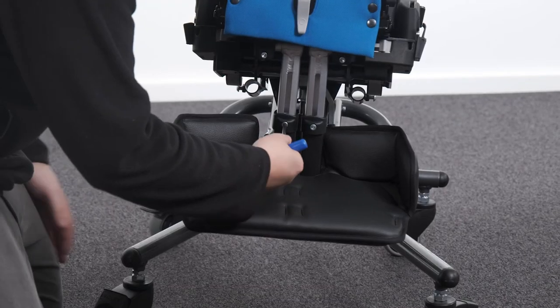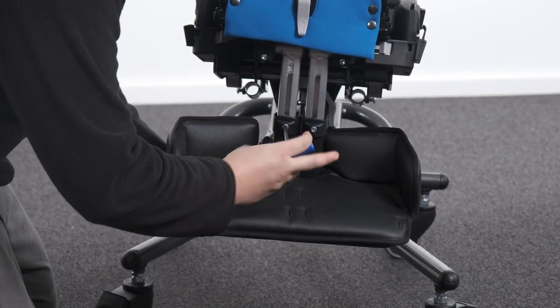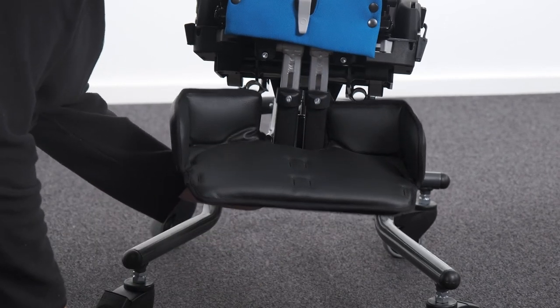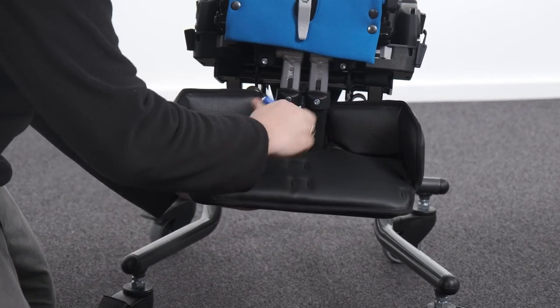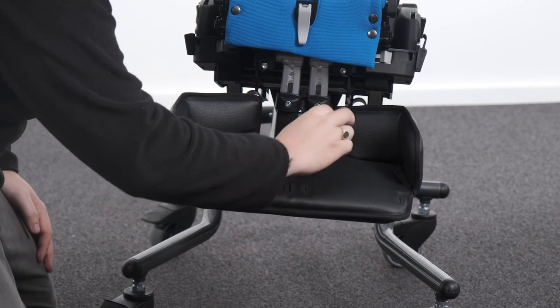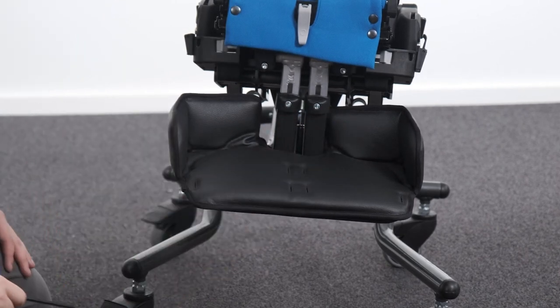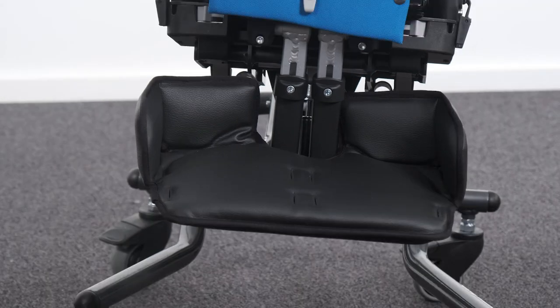Adjusting footrest length. To adjust the footrest height, loosen the bolt and lengthen or shorten the height of the footrest to the desired position. Tighten the bolt to secure in position. For the individual footrests, the height can be adjusted independently. For the one-piece footrests, the bolts need to loosen simultaneously to allow for adjustment.